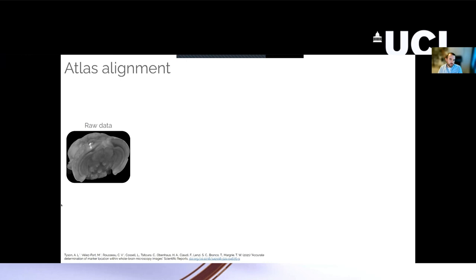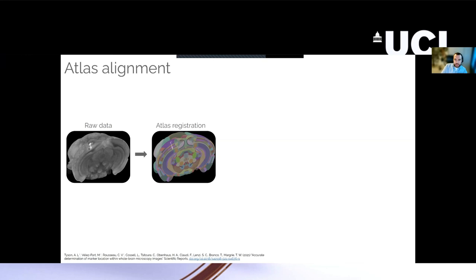And then the next step, which is roughly common to all the methods that you might be able to use, is to take your raw data. Again, this is the same data set, just in a slightly different format. The image has been cut in half so you can see part of the probe here. And then you align this data, you register it to an atlas.